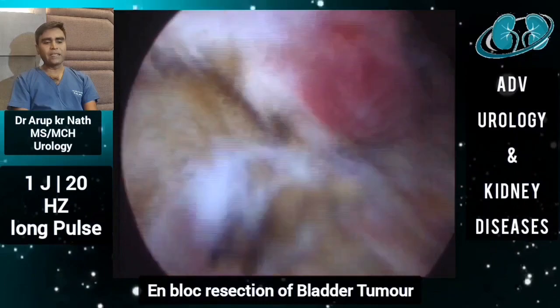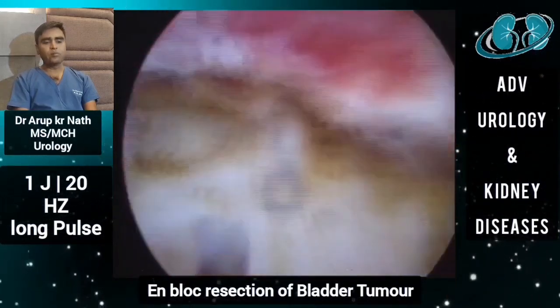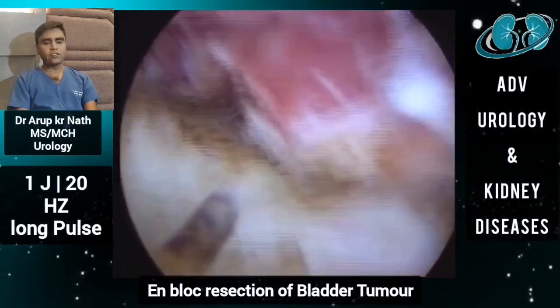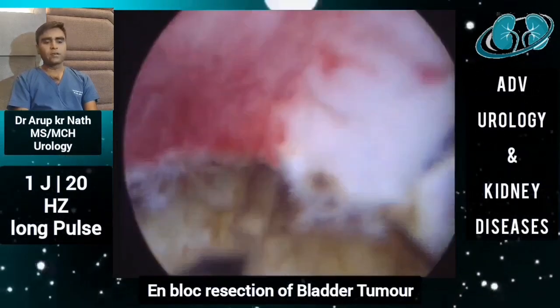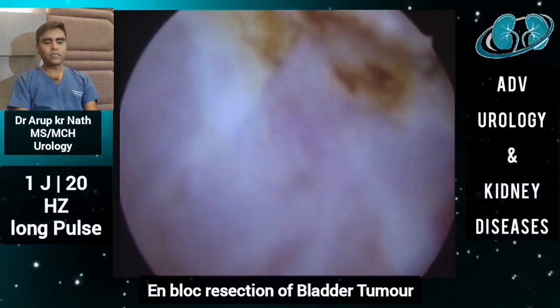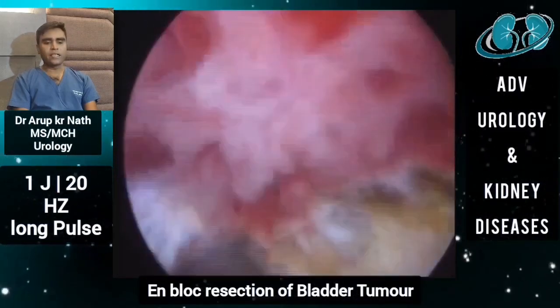We do not encounter bleeding. We do not encounter any obturator jerk, which is a difficult situation during transurethral resection of bladder tumor using monopolar cautery. That sudden jerk may lead to perforation of the bladder, which we do not get with en-bloc resection of bladder tumor using laser energy.